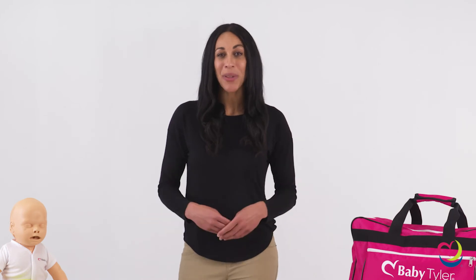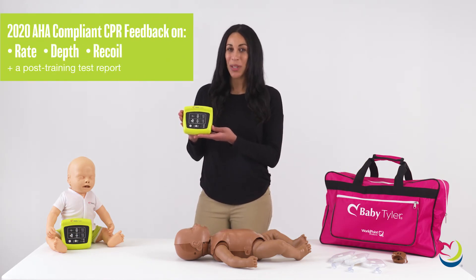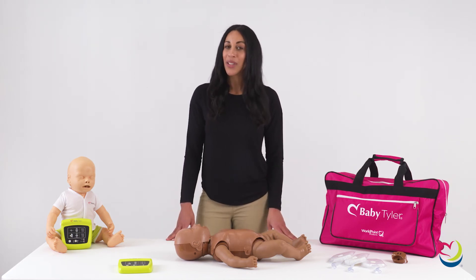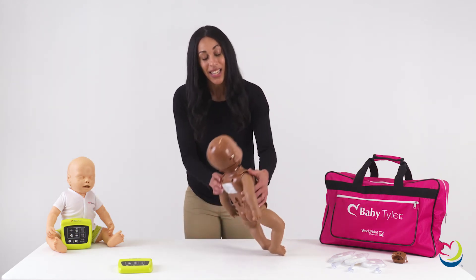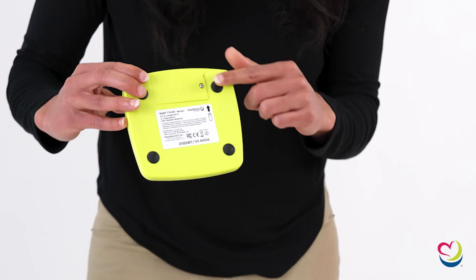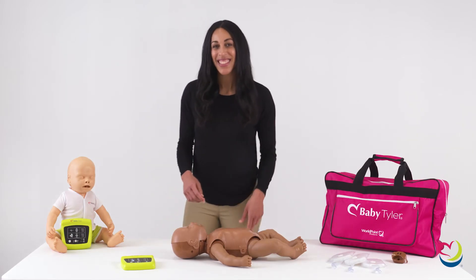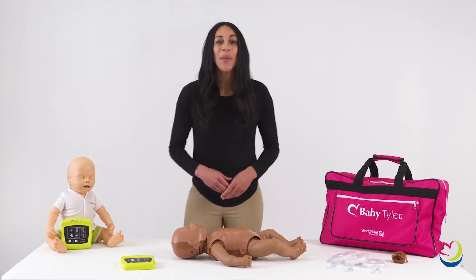Now your Baby Tyler is ready to be paired with the CPR monitor. The CPR monitor offers 2020 AHA guideline-compliant infant CPR feedback in standard mode as well as blind mode, in addition to a test report given 10 seconds after the practice session has finished. In blind mode, the feedback is not visible during practice; however, the test report will still be visible after the session has been completed. To pair Baby Tyler with the CPR monitor, insert the batteries into the mannequin and the monitor. Switch on the monitor using the power button and compress the torso until you hear a beep sound and the torso light on the monitor turns green. Baby Tyler is now ready for use.